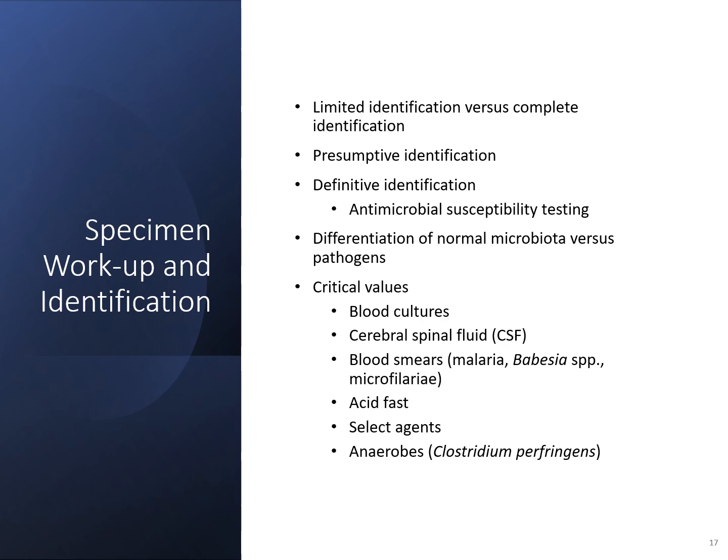So if you're doing a spinal fluid in the micro lab and you do a gram stain and you see organisms in that gram stain, then you need to call the physician and alert them versus reporting it in the computer. Something like a urine culture would just be reported in the computer and the physician would get the results and see the results versus having to call a urine result.